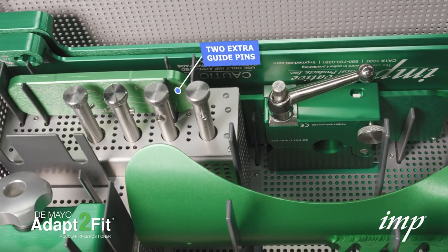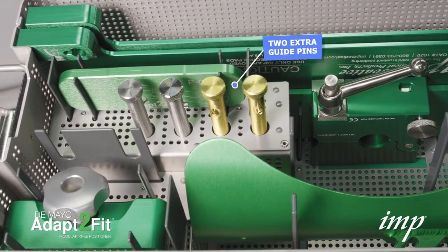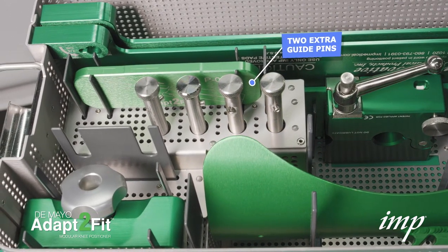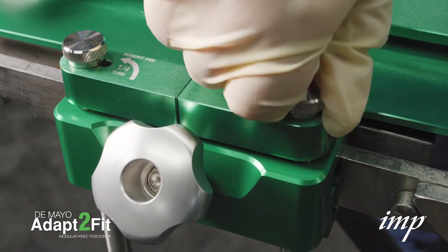Please note, only two guide pins are needed to set up the positioner. Two extra guide pins have been provided in case of dropping or missing pins. Place the other guide pin into the base plate and a waiting clamp.